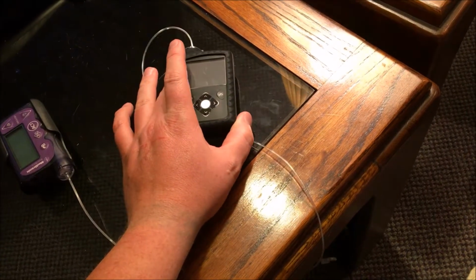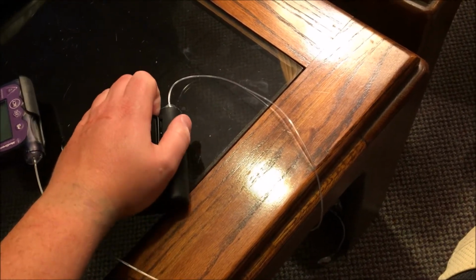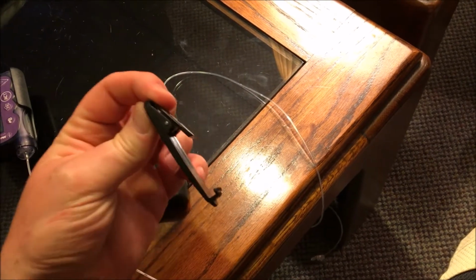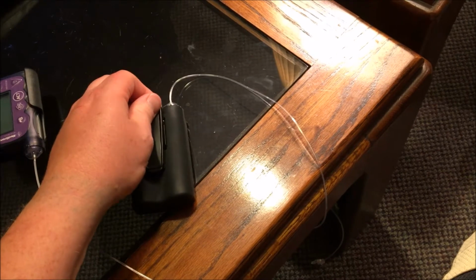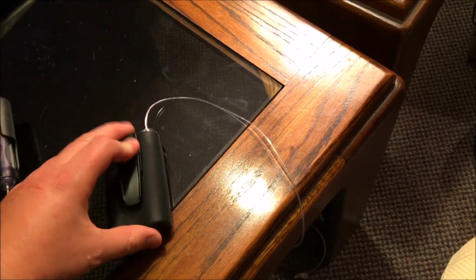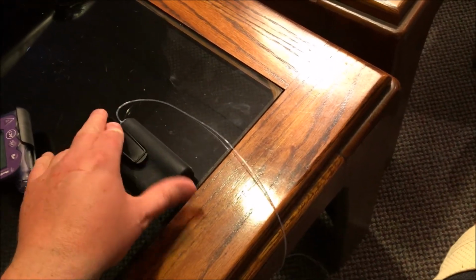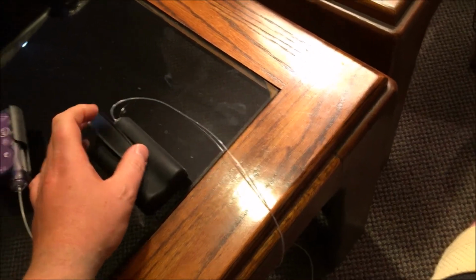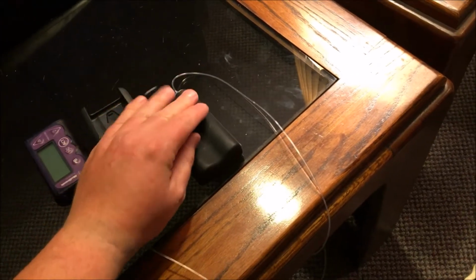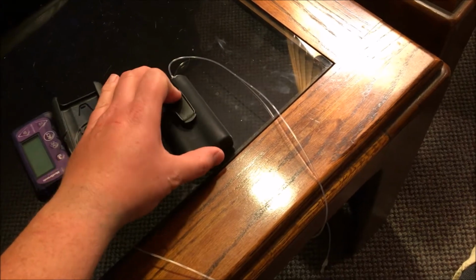Now this, I can't do that so much. I've looked for a holster. I've not found one. It seems that they only really have this clip, and this clip is attached to the actual pump. It slides out like that. So I can't really leave that on my belt. So every time I do this, I have to completely unhook it from my belt. And so then I have to take it all out like that, do my insulin, then put it back, clip it back. And you say, oh, that's not that big of a deal, but it's quite a bit more of a hassle. I could literally do that in not very much time at all. It's just like boom, and this I tend to fart around a bit more.